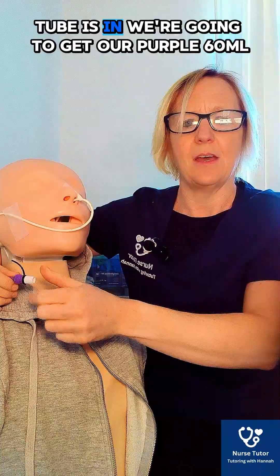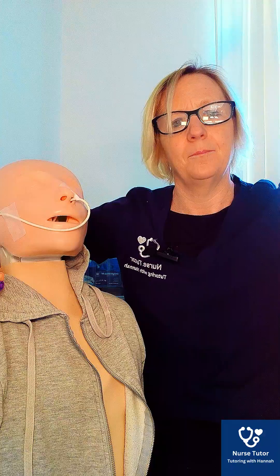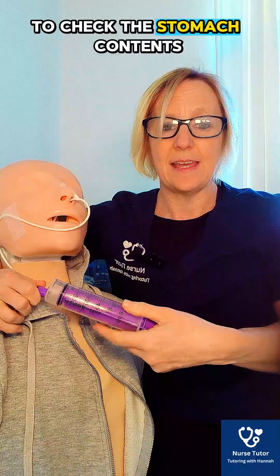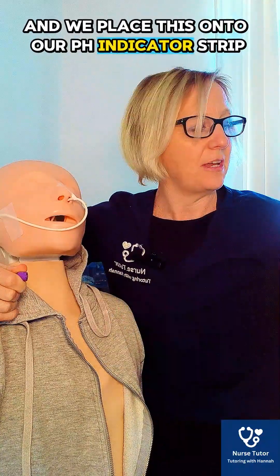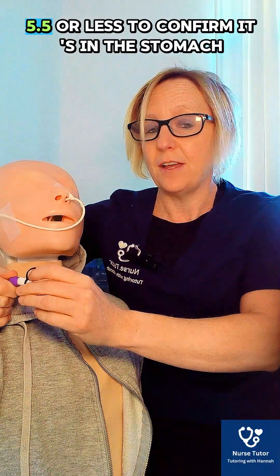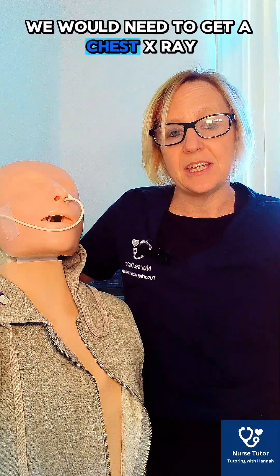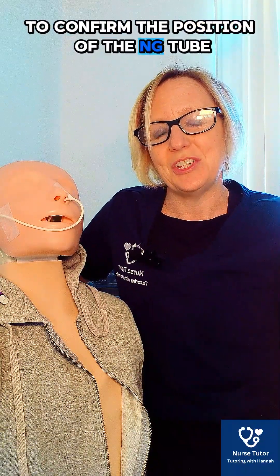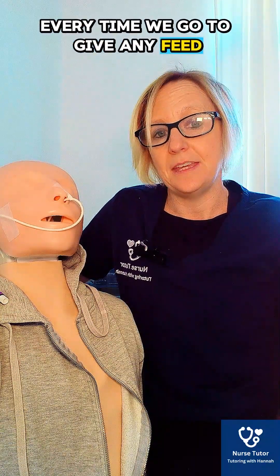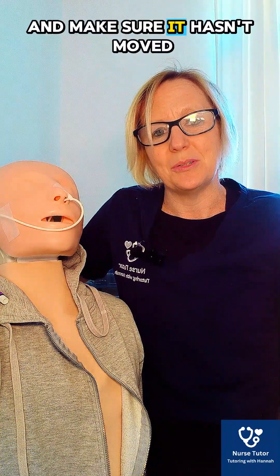Once the tube is in, we get our purple 60ml syringe and aspirate no more than five mils to check the stomach contents. We place this onto our pH indicator strip and confirm that the pH is 5.5 or less to confirm it's in the stomach. If it's more than 5.5, we would need a chest X-ray to confirm the position of the NG tube. We document this in the notes, and we must also recheck the position of the NG tube every time before we give any feed or medication to make sure it hasn't moved.